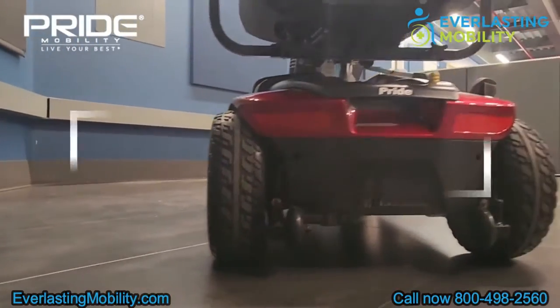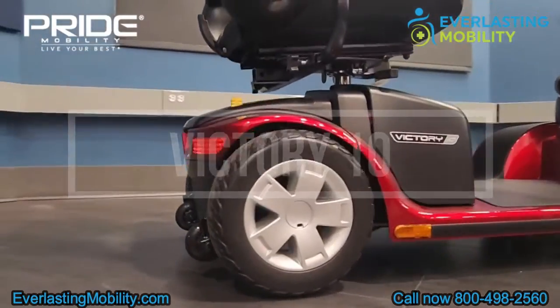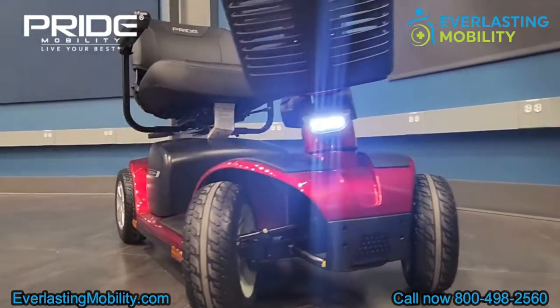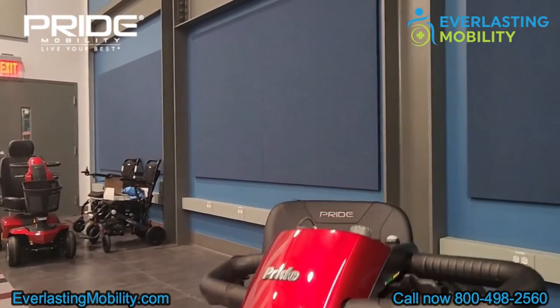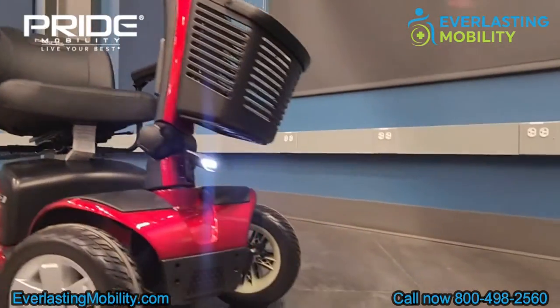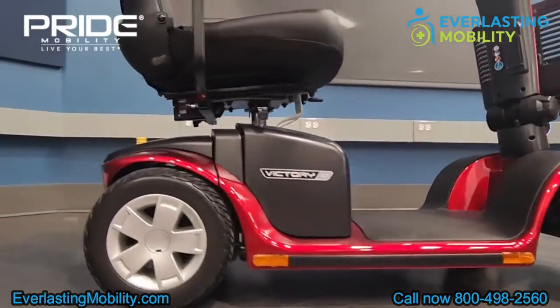In this particular video, we're going to go over the Pride Victory 10 four-wheel mobility scooter. The scooter can support up to 400 pounds of weight. It has a top speed of around 5.3 miles per hour. The battery range is over 15 miles per charge. It has large tires, and it can even be broken down with Pride's feather touch disassembly technology. Let's show you some more features about the Victory 10.